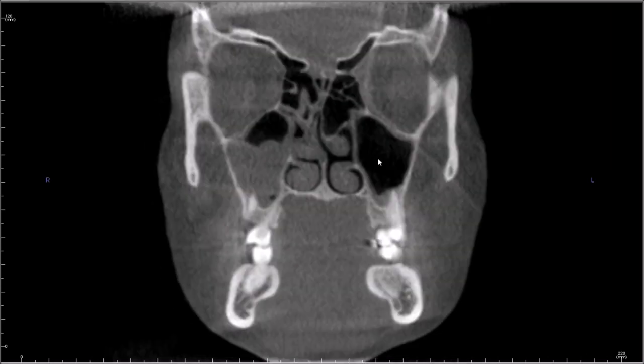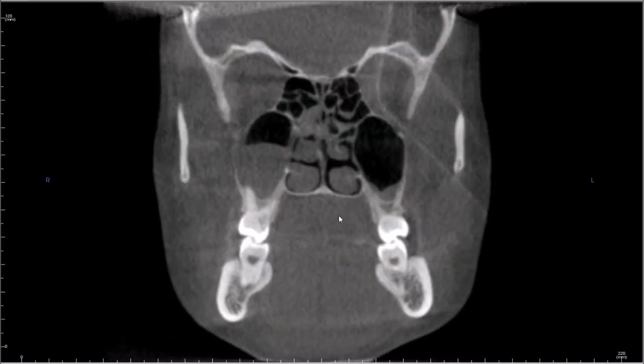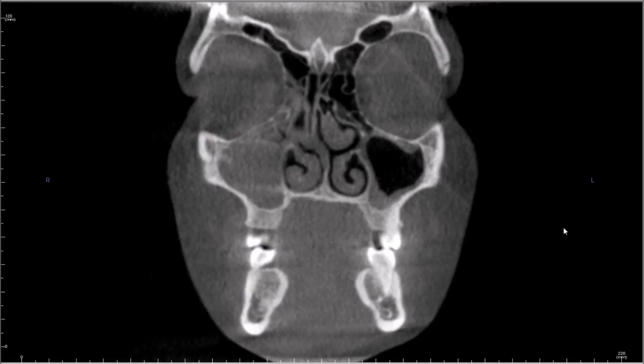So I'm obviously not going to go over every possible anatomical structure in this short little 5-minute video. This is just a little introduction. I'm in the process of creating a more comprehensive course on cone beam interpretation, so stay tuned for that and let me know if you're interested.